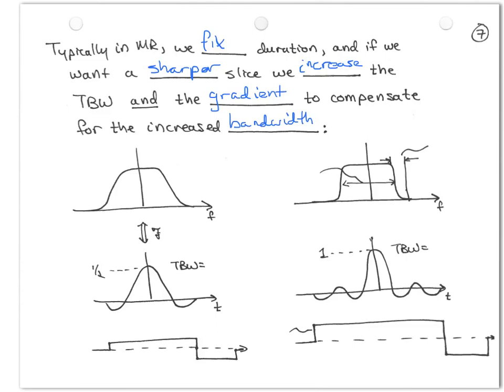Okay, so here's an example of that. Let's say we have the following target slice profile here, and we can excite this with a time bandwidth 4 pulse.